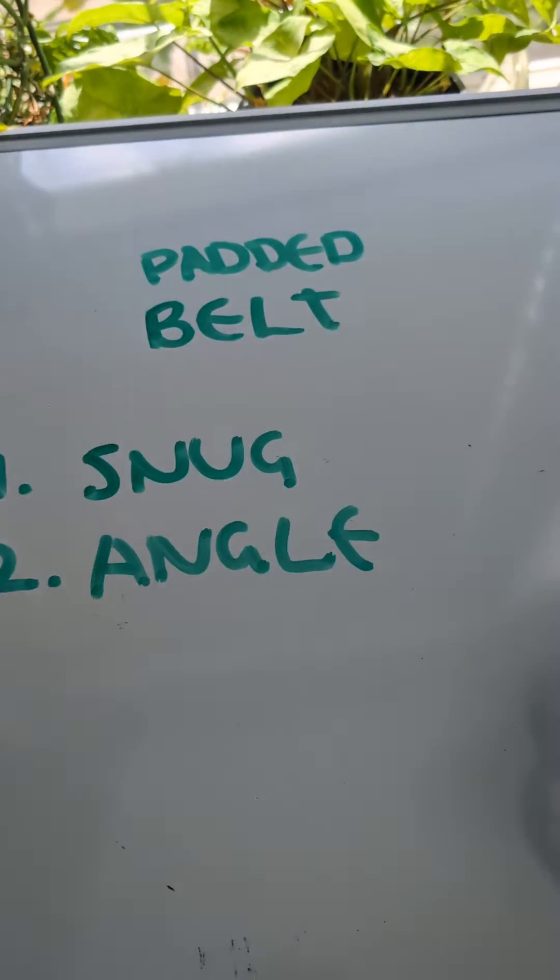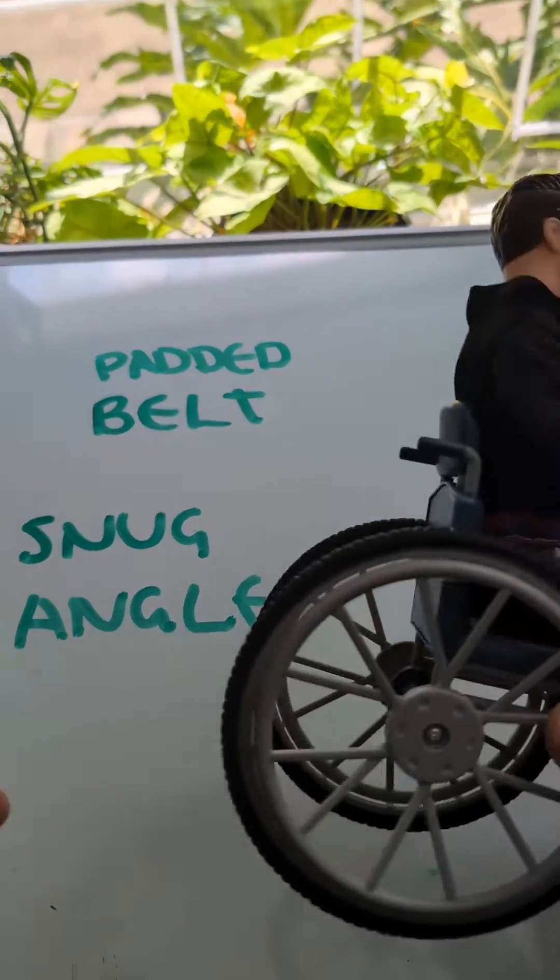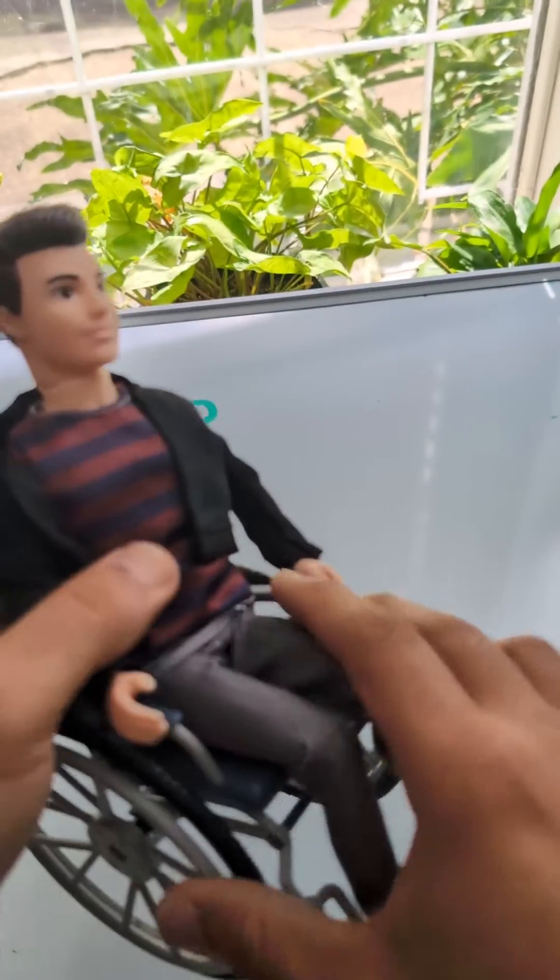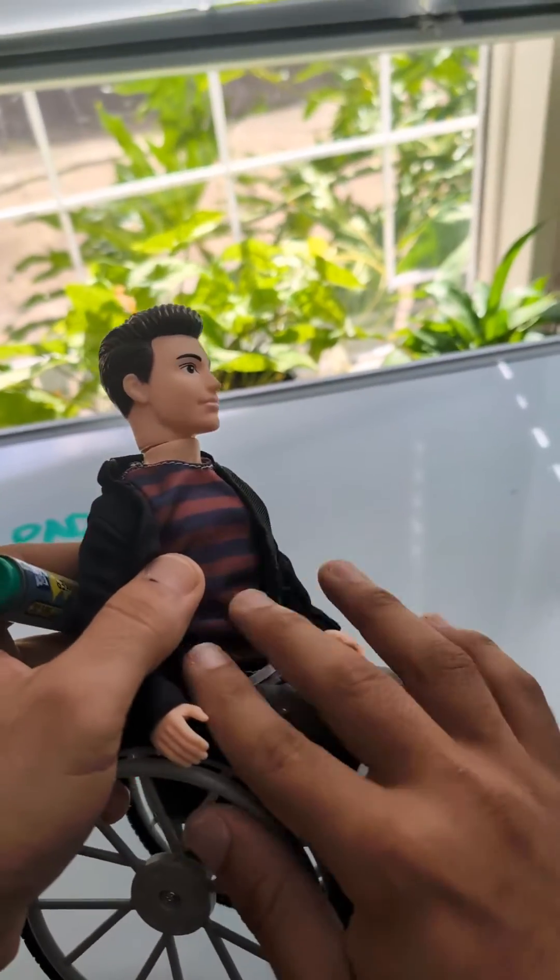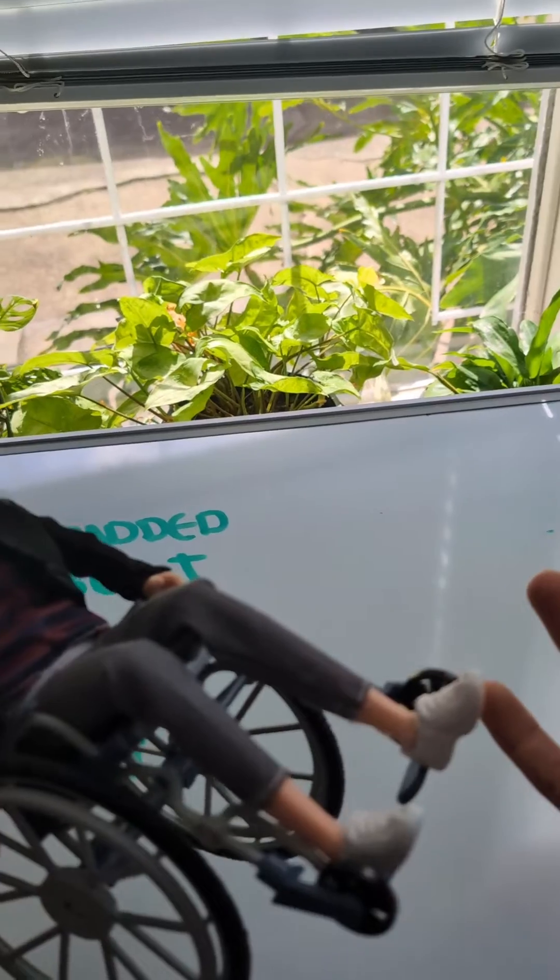A padded belt. Now, a padded belt needs to be snug, and it needs to be at the right angle. Snug meaning if it's just loose and you can fit your hand or something underneath it, it's not really doing anything.